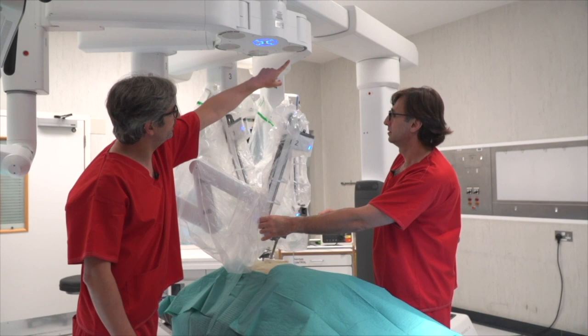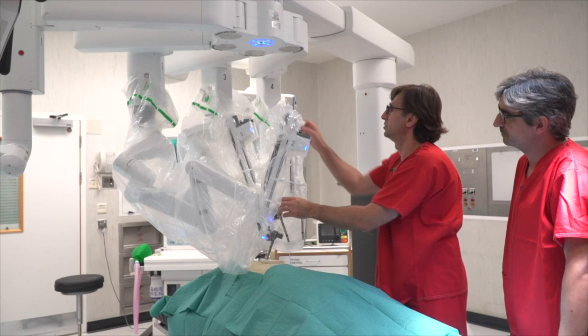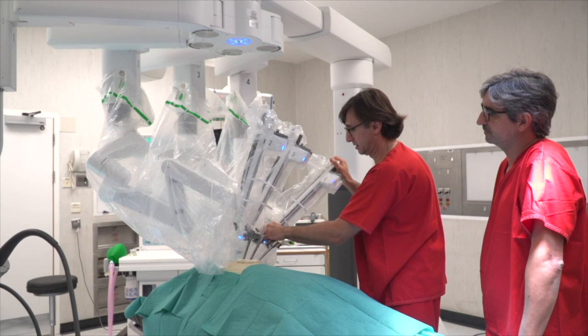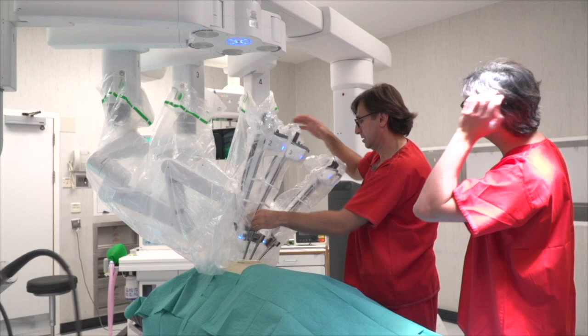So, the second trocar, thank you. Put all the trocars now. Give me the third trocar, please. Thank you. Workspace may be limited. We put the trocars and then, with this mark, the big black mark at the edge, and then arrange here. So, third arm, like this. Equal space there, in the middle of the letters. Maybe to separate this, move three and four a bit closer. Four. You move like this? Yes.